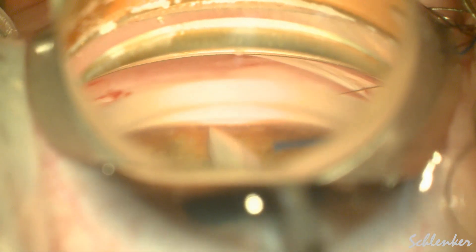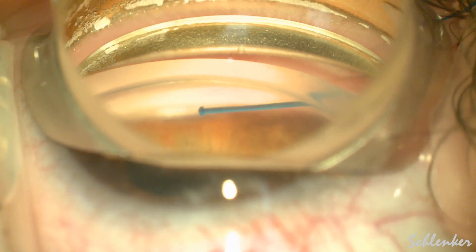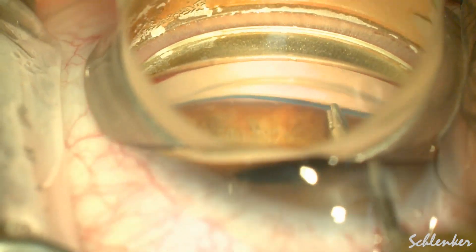So here we are now starting our GATT with an MVR blade. I like to start a little bit on the right side of my field, just in case I have to do another incision area. And I was quite reassured here because I felt like there was almost like a membrane in front of the TM, as if there was an outflow problem that we can easily address with this technique.